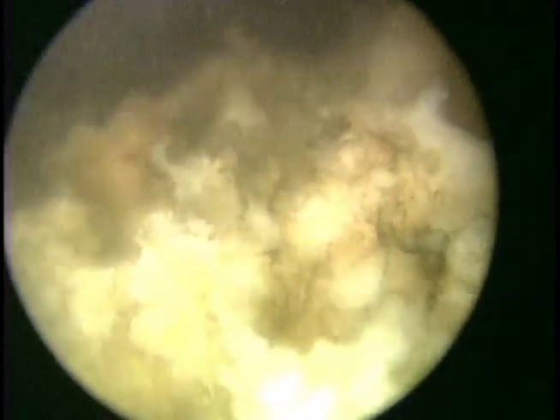We continue to work on the floor, which is obviously the bulk of this gentleman's obstruction, coming from a 5 o'clock direction now to meet with the floor at the 6 o'clock and 7 o'clock areas. Once we have debulked the majority of this tissue, simple pure vaporization can be done centripetally toward the capsule over this area. We can also readdress this issue nearing the end of the procedure once the lateral lobes have been properly addressed.